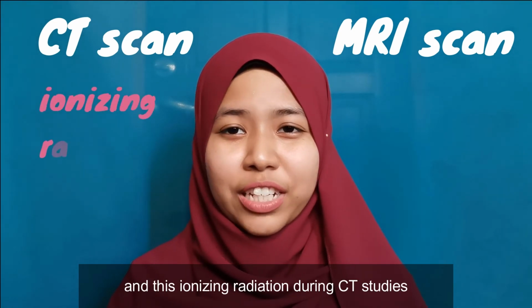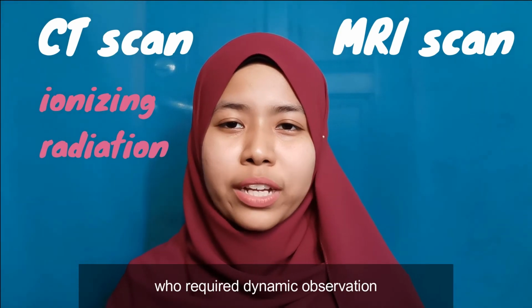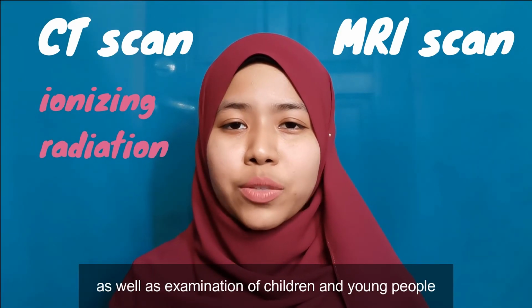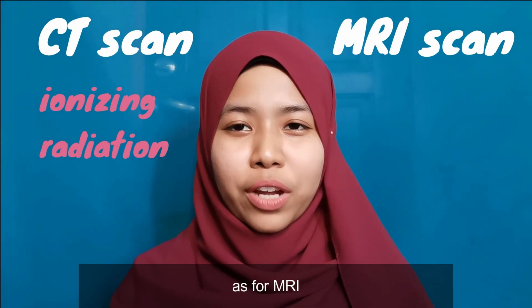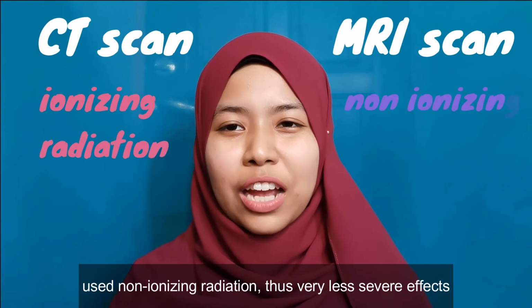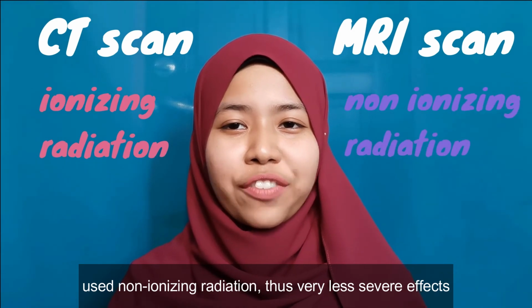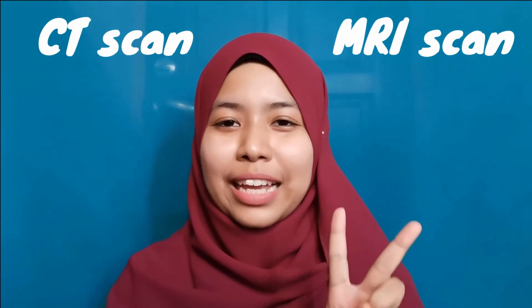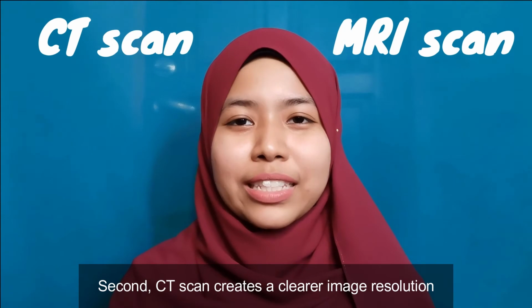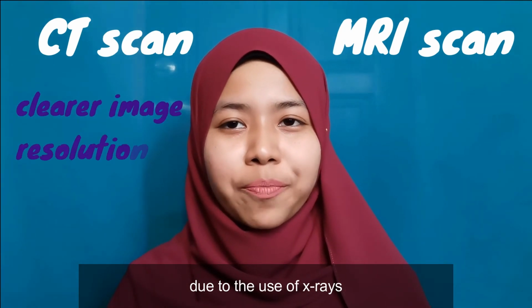This ionizing radiation during CT studies causes concern for patients who require dynamic observations, as well as examination of children and young people. As for MRI, it uses non-ionizing radiation, thus having much less severe effects on the skin compared to the CT scan. Second, CT scan creates a clearer image resolution due to the use of X-rays.